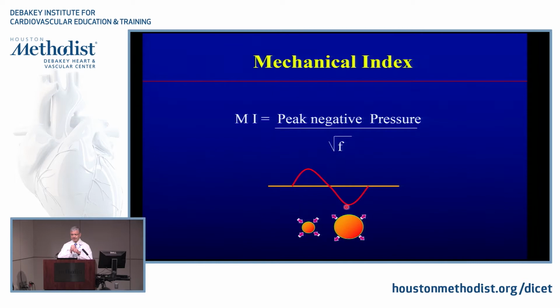We're talking about fractions of milliseconds, but the one that hurts the bubble the most is the negative pressure, because I can compress it and I'm not going to destroy it. But if you expand it, just like blowing up a balloon, you're going to burst the balloon. Okay? So a high mechanical index will basically destroy quite a few of these microbubbles.